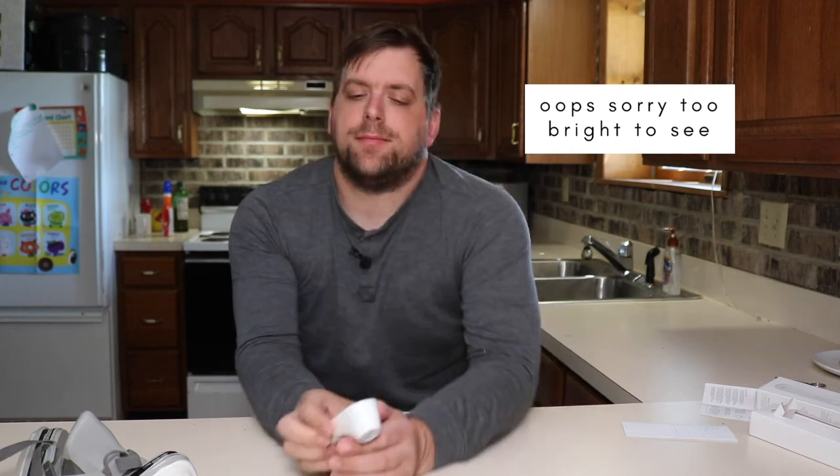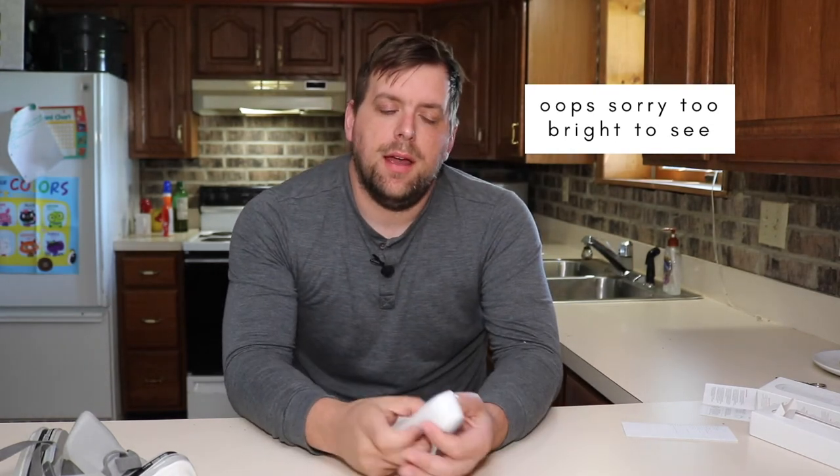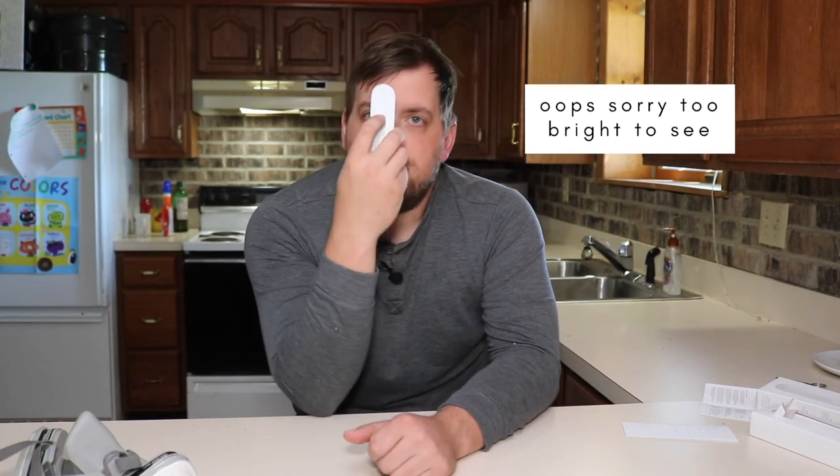When it vibrates, it gets a reading — 97.7. And just to show the accuracy, I do it again: 97.8. My hair might have been in the way — 98.7.